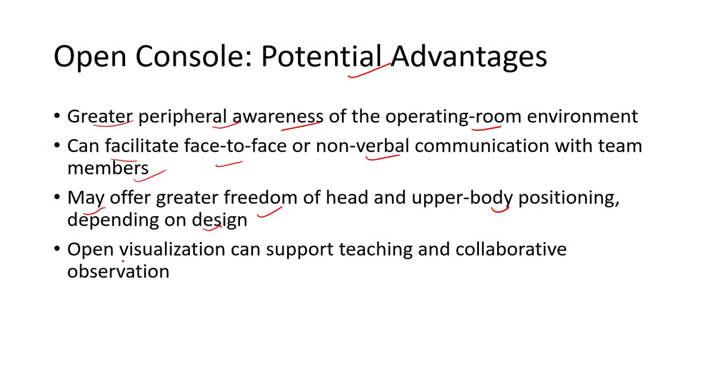Open visualization can also support teaching and collaborative observation. In front of the console is the operating surgeon, and just beside the operating surgeon, one, two or three surgeons can sit and see how the surgery is going on.